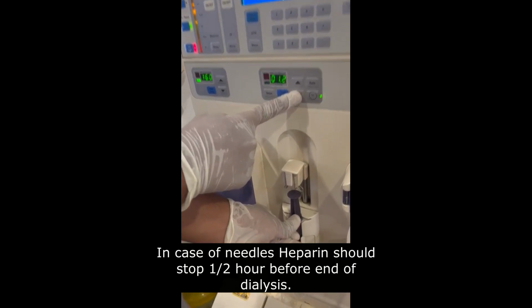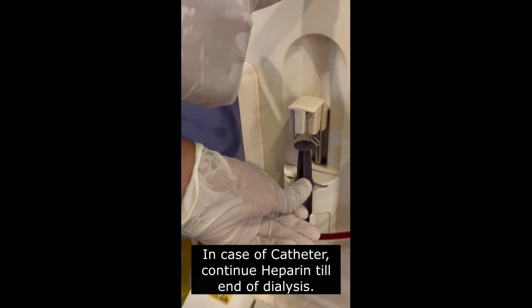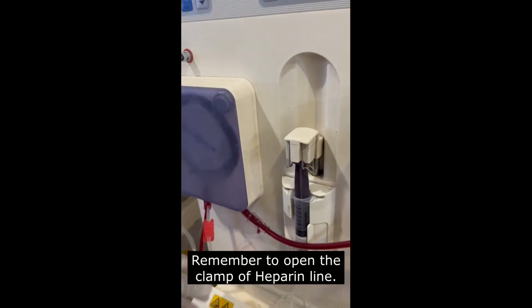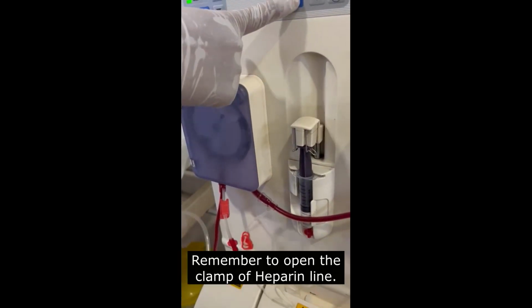For needles, stop heparin half an hour before the end of dialysis. For catheters, continue till the end. Remember to open the clamp of the heparin line.